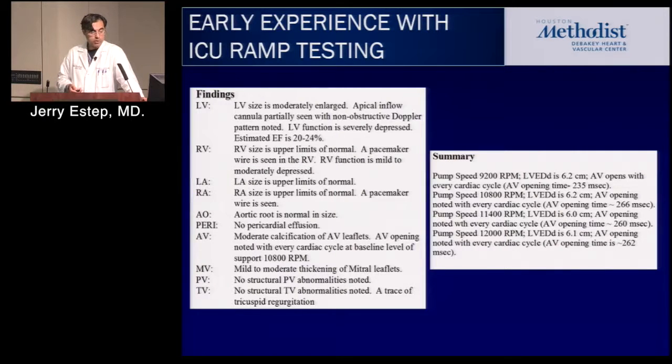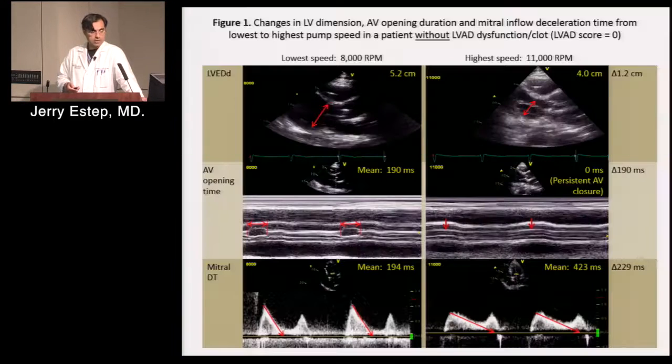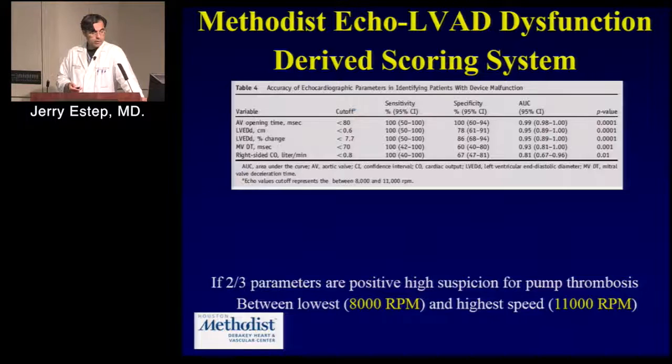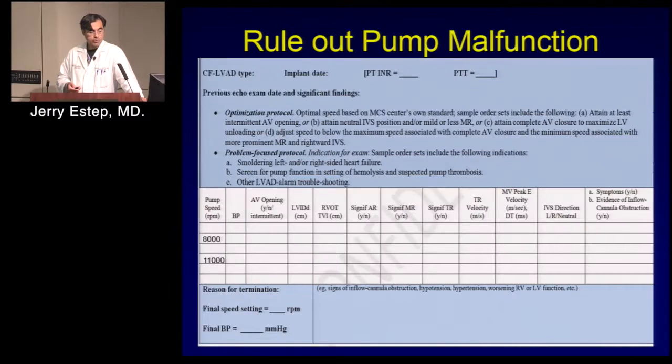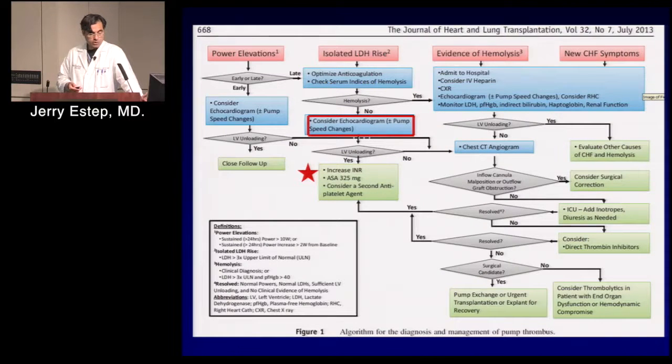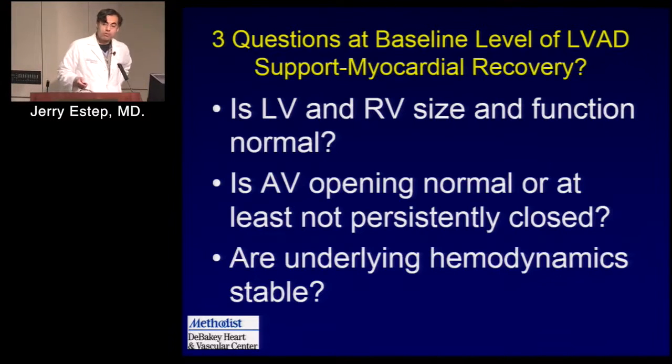And we go through our algorithm, and so the hope is to have a report that captures that based on size and aortic valve function. Mitral valve deceleration would be helpful, but if you just capture LV size and aortic valve status, that'd be key. So this is our derived scoring system based upon these measurements, and if you just describe it in the report, that's helpful. And we use it clinically. I'm not going to go through this algorithm. If we see pump malfunction from hemolysis, we pursue exchange. Dr. Ash created this TPA lysis protocol, which we're experimenting with, which is working, which we may give. You guys laugh as you know Dr. Ash. And then recovery comes up. It's still a low frequency phenomenon.